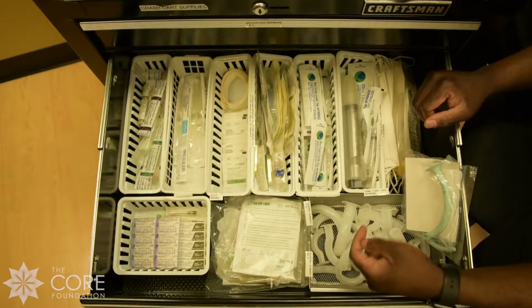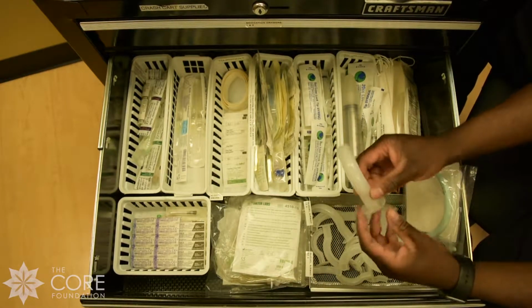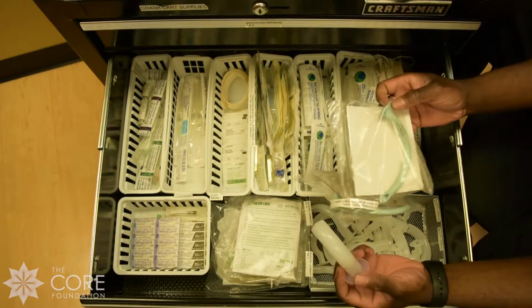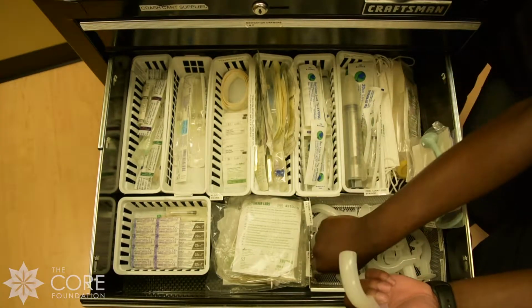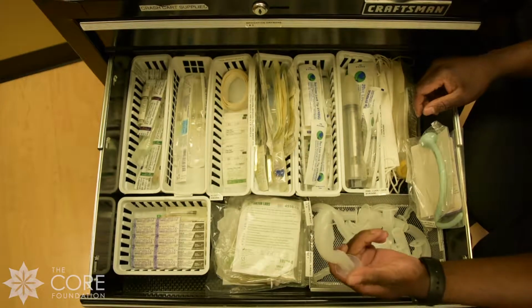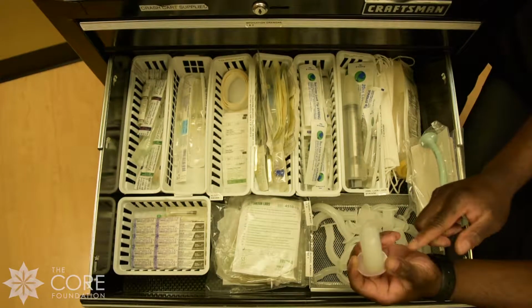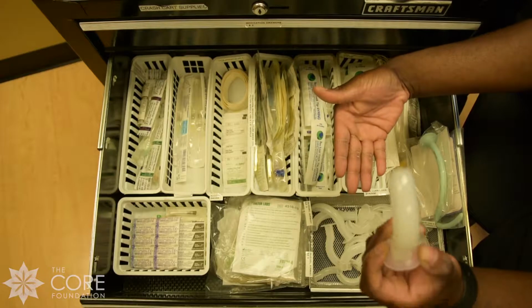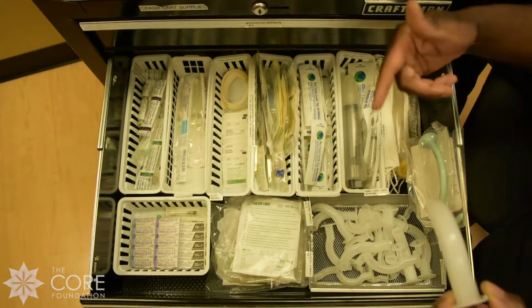And then in here, this is one of my favorite things. This is the airway opener. We have a couple of different sizes. This is for kids, the little green one, and the white ones are for teenagers and adults. We also have some for little small kids. The way this works is you place it in the mouth like this. Pretend your patient is facing you this way, and then you'll place this in there. Use it to pull the tongue back. That way you can see through it.